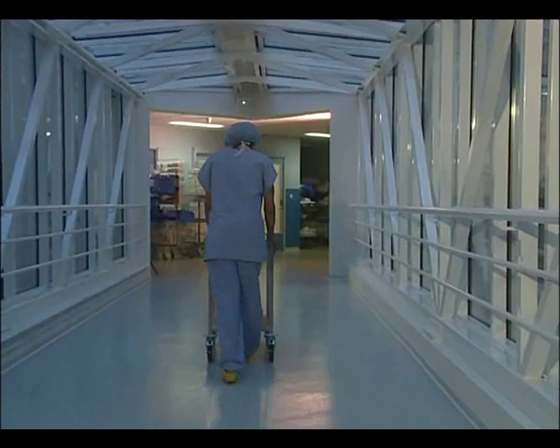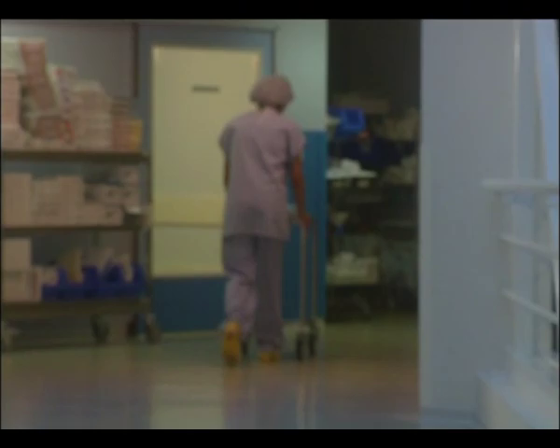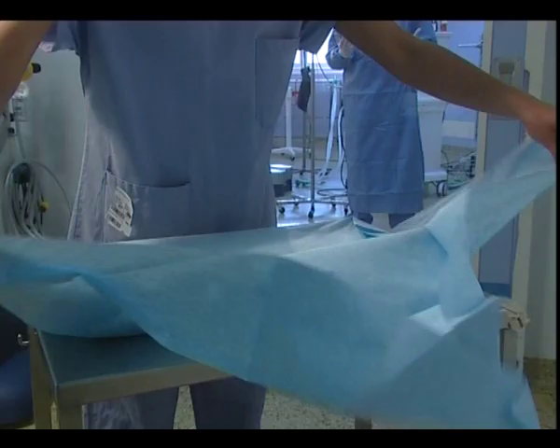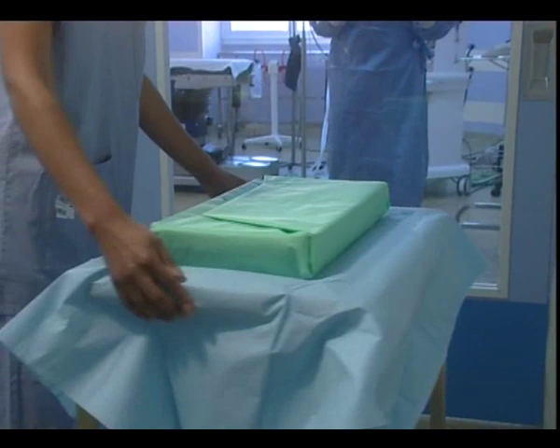Transportation from the place of storage to the operating room is done by trolley. Friction and handling are to be avoided. Before entering the operating room, it is recommended to remove the outer wrap in order to avoid introducing any particle contaminations accumulated during storage or transport.